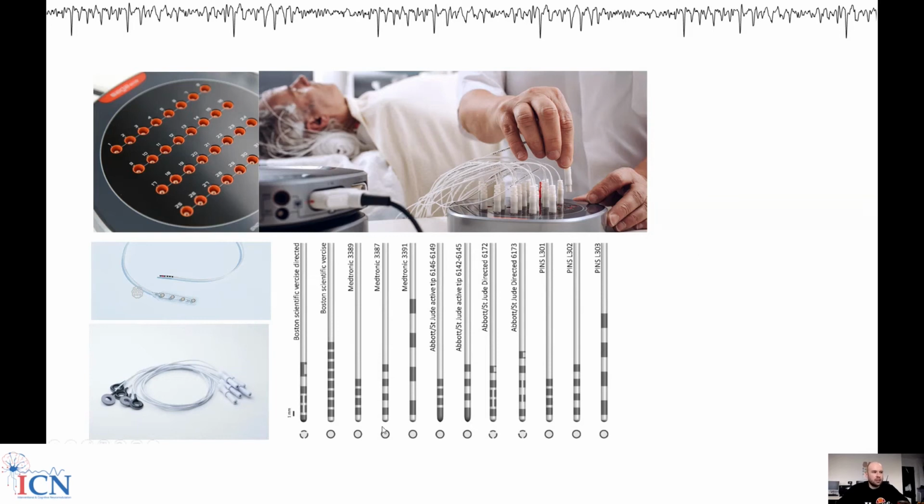And Medtronic is coming out. Medtronic has this implantable pulse generator that can also record LFP, the Medtronic Percept device. And they have announced a directional lead since many years now. From what I heard and what I can imagine, the reason why it has not come out just yet is that it is super difficult to create an electrode that is both directional and still has reliable capability to capture LFP.